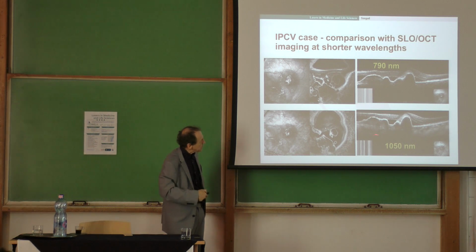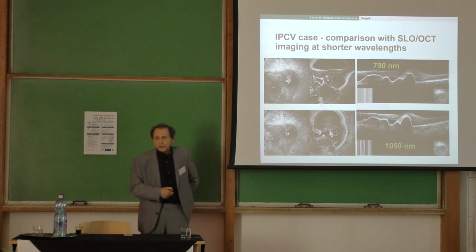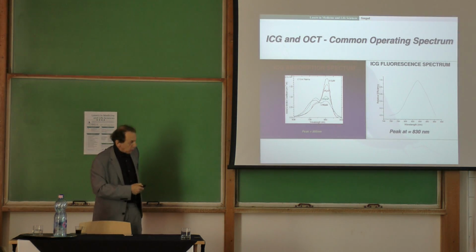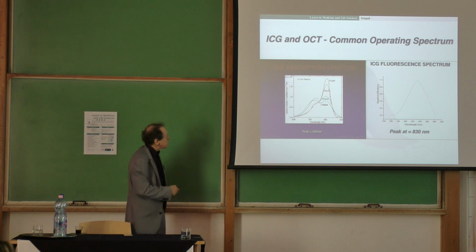So obviously here penetrated more. Look what happens in the eye. Do you see that this patient still sees? Yes, it does. But sees only a little bit because the fovea is so distorted here. There is a lot going on here. So that's the concept of fluorescence. Okay, I have 7 more minutes.